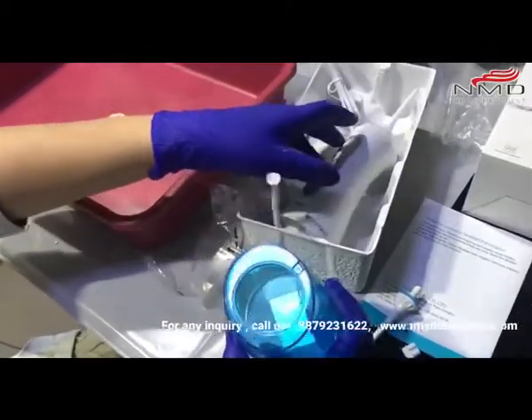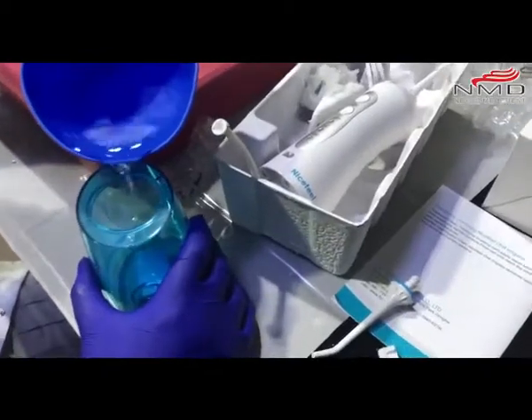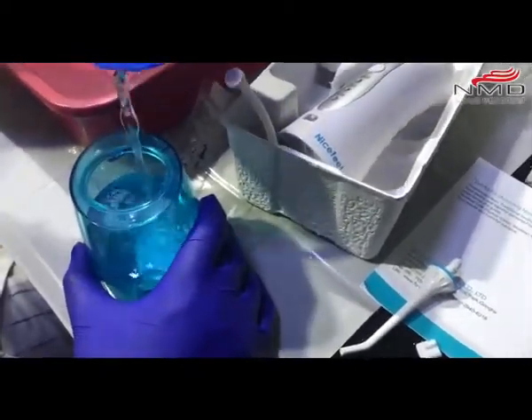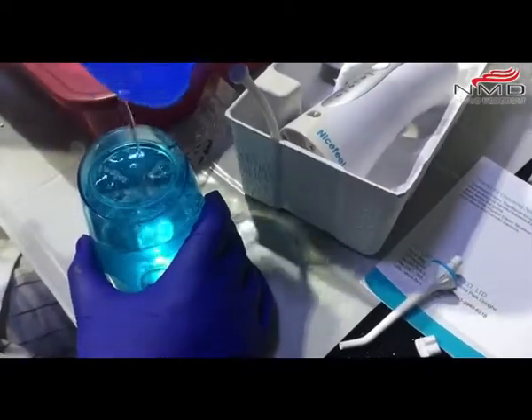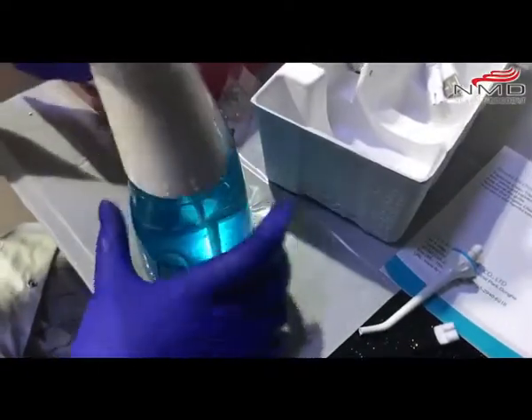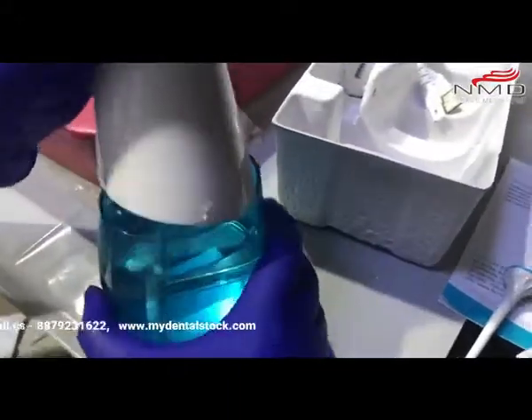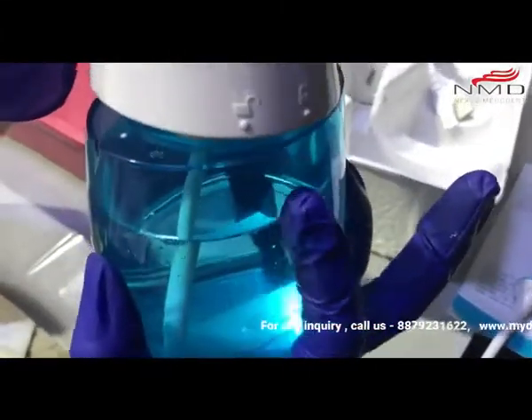Let me pour some water. As I said, it has 220 ml capacity, so you can fill it this much. Actually it's more than 220 — it's about 300 ml.